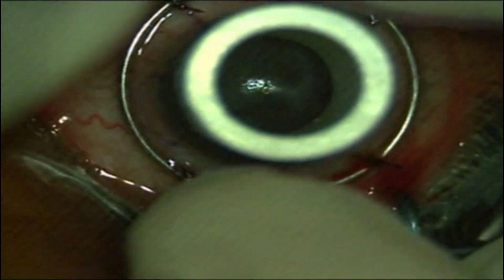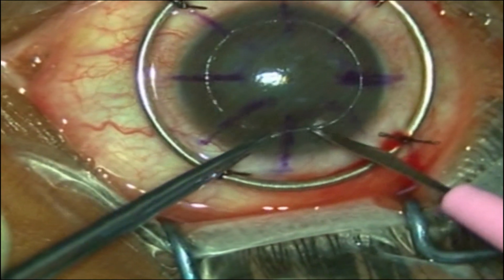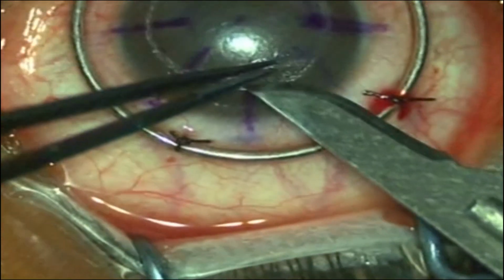This case is a 26-year-old male with a macular corneal dystrophy. He has had a successful penetrating keratoplasty in the other eye 2 years back. A partial thickness dissection is done to remove the anterior stromal layers.